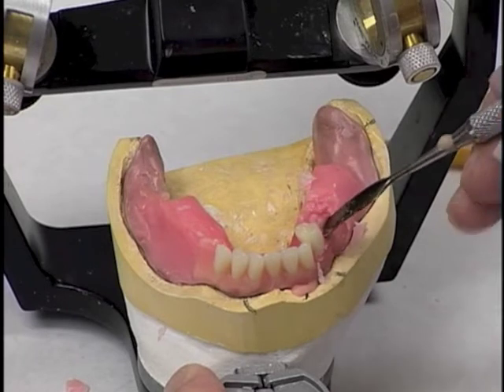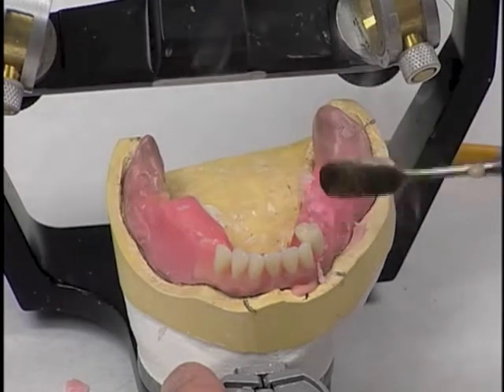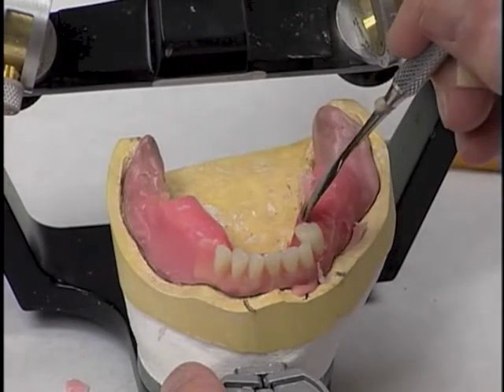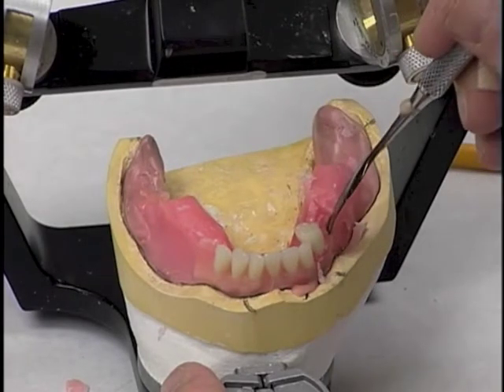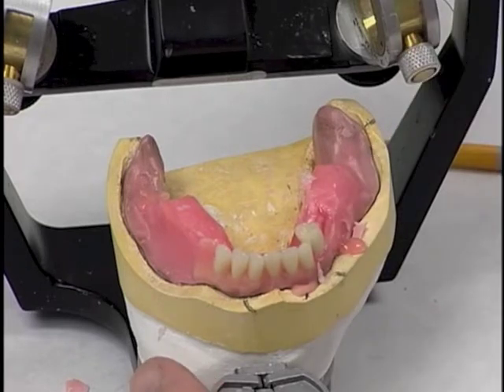Once we think we have the wax softened enough, then we're just going to place that tooth, making absolutely certain we have the correct buccolingual position of the teeth, as well as keeping all cusps of that posterior tooth, that first molar, on the flat occlusal plane.